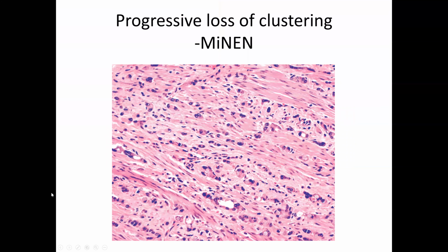Ideally, you want to see both some degree of neuroendocrine differentiation and clear-cut carcinoma. Although previously people have used the 30% cutoff, requiring that you have at least 30% of the tumor composed of one or the other of those elements, I don't think that's a totally hard and fast rule if you've got a substantial portion.